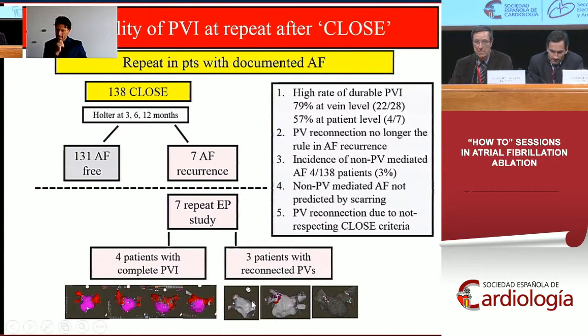But our 3 gaps. Basically one gap in this patient was at the anterior carina, and you will be surprised and say the story is too beautiful, but at that site we did not reach transmurality according to the index. So that is number 1.